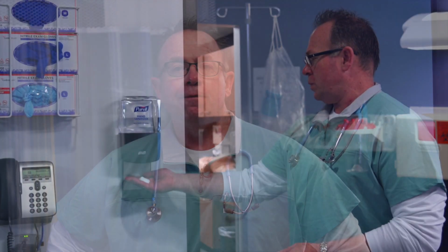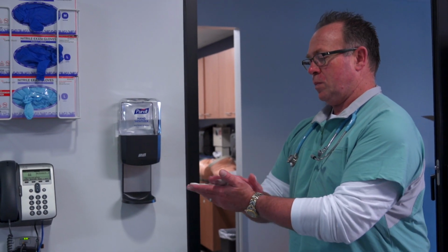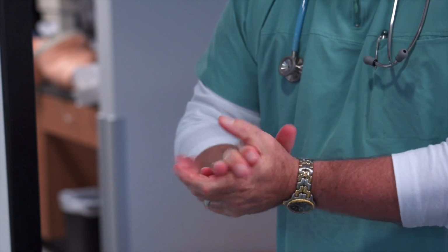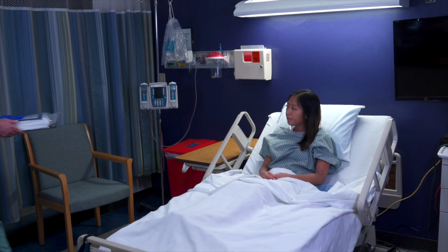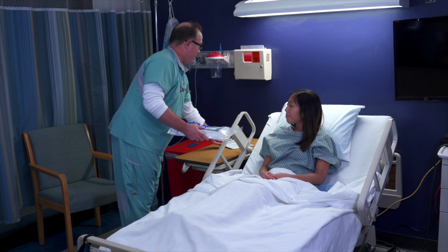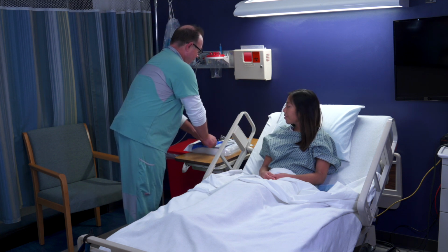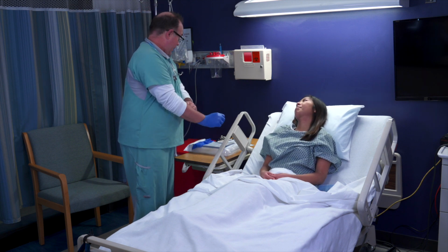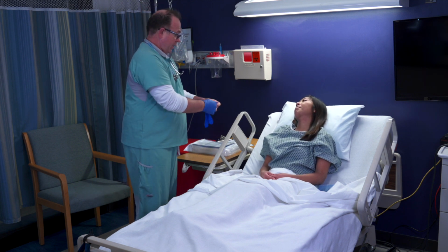Unless clinically indicated, use the smallest catheter French size possible consistent with good drainage to minimize bladder neck and urethral trauma. Perform hand hygiene immediately before and after insertion or any manipulation of the catheter device or site. Begin by gathering your supplies. You'll need a Foley catheter closed system tray, perineal cleansing supplies in accordance with your facility's policy and procedure, and additional clean gloves. Start by donning non-sterile gloves.